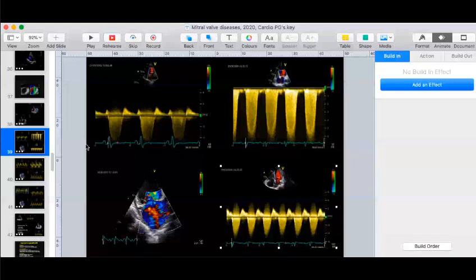So this is continuous Doppler, looking at the severity. How do you assess severity? Looking at density, forward flow, and how dense it is, and the characteristic features of MR I showed you, and then this triangular shaping of the MR, which is indicative of severe MR.